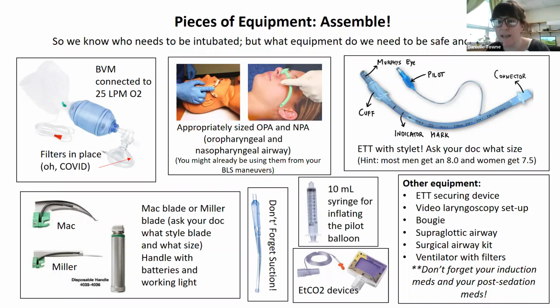We've got supraglottic airways, so those are our LMAs that you can place without doing a full intubation. What it does is it goes in and sits right above the trachea and the vocal cords, and a balloon inflates to hold that in place. It's not a definitive airway though, because it's not actually going through the vocal cords into the trachea, which is making sure that it's truly going into the lungs. When you do a supraglottic, you have the potential to still have air escaping into the stomach.